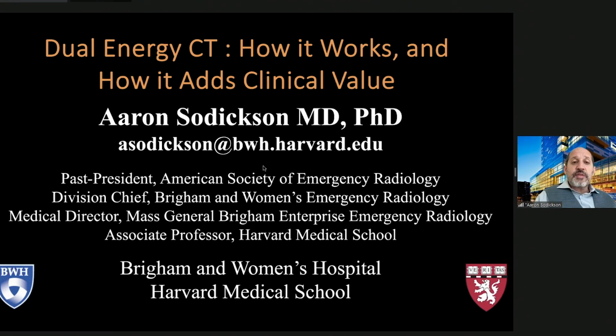But yes, we do have to be conscious of how long it takes to create those images. We need an efficient workflow to do that automatically that doesn't add burden to our technologists or our radiologists. And we need to make sure that our PACS IT folks don't get unhappy with us for the extra burden that we're placing on the systems.